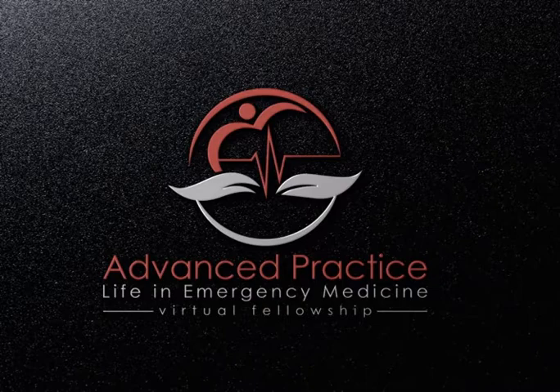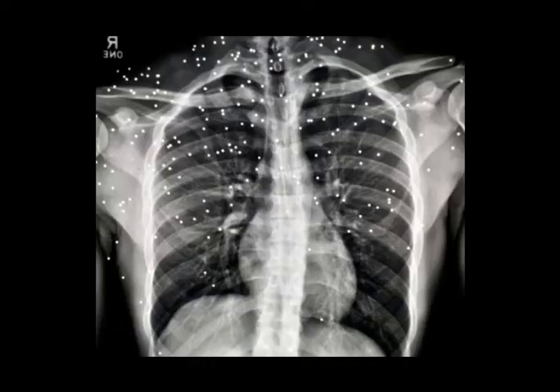Every chest x-ray should be systematic, and you should develop this same repeated process every single time. Just make this a habit. Before beginning, I think it's important to quickly talk about why we would get a chest x-ray. Some of these indications would be, of course, chest pain, productive cough, dyspnea or shortness of breath, cough in the setting of weight loss, and any focal chest signs or symptoms on your exam.